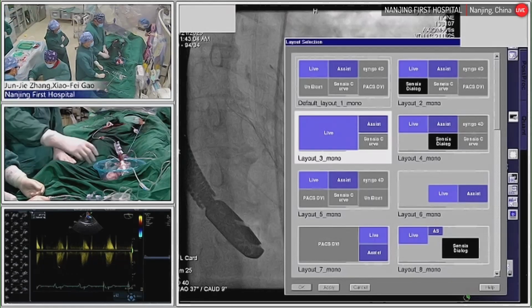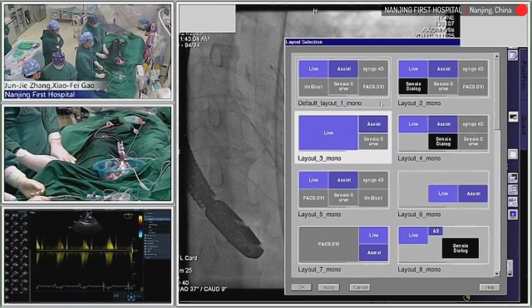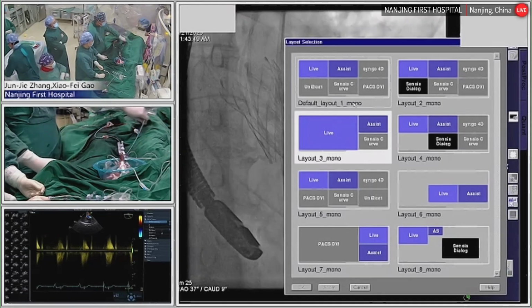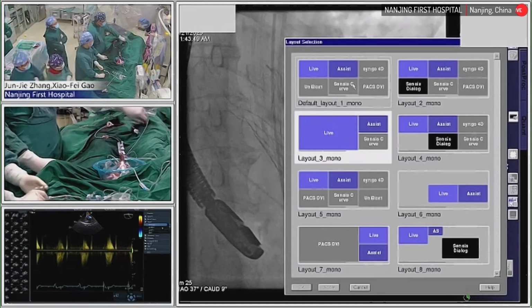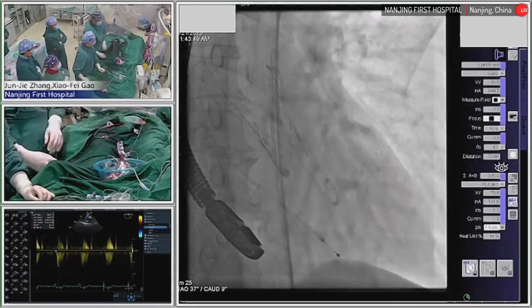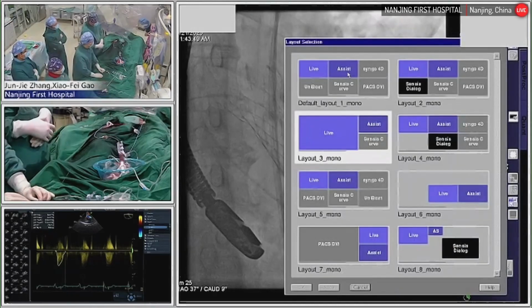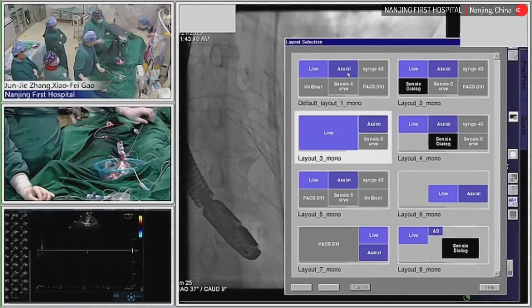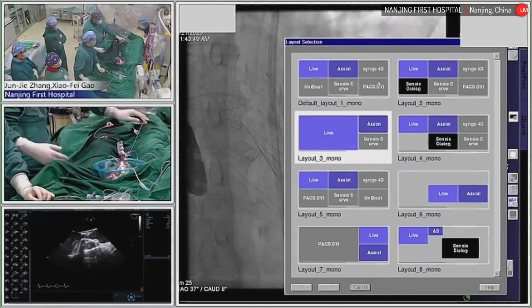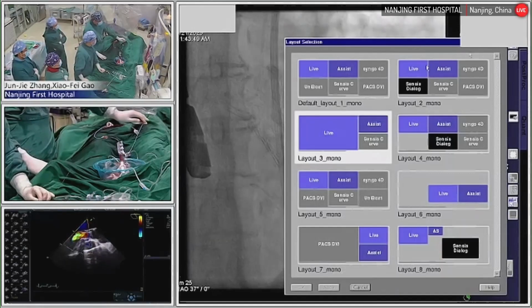Prof, the maximum prosthetic valve velocity is about 1.4. That's good. And the mean pressure gradient, I just measured it out. I think it is normal. Okay. So very eccentric calcium nodule, it is in about the carina. So I will use a smaller balloon. I think the 18 balloon is safer for post dilation. Yeah, avoid the aortic root injury.